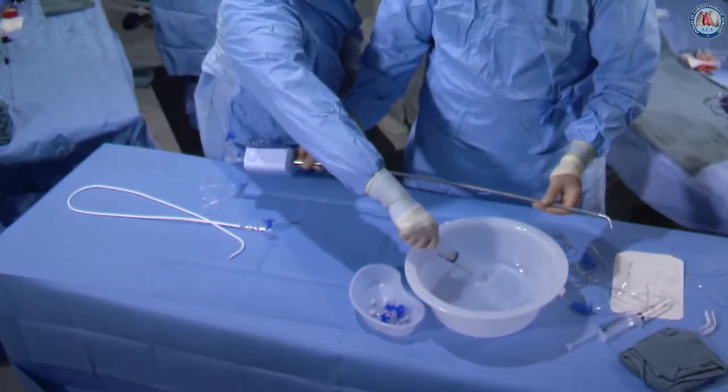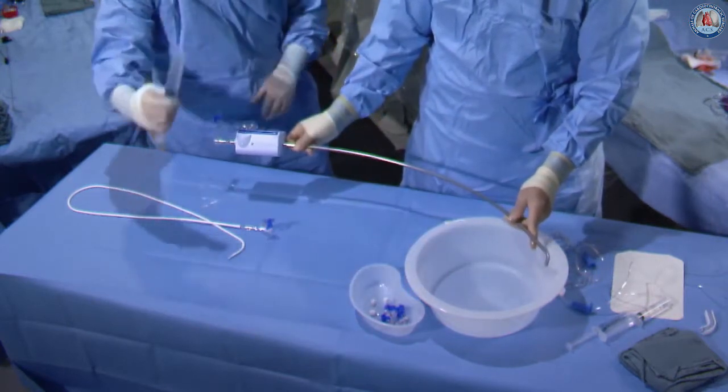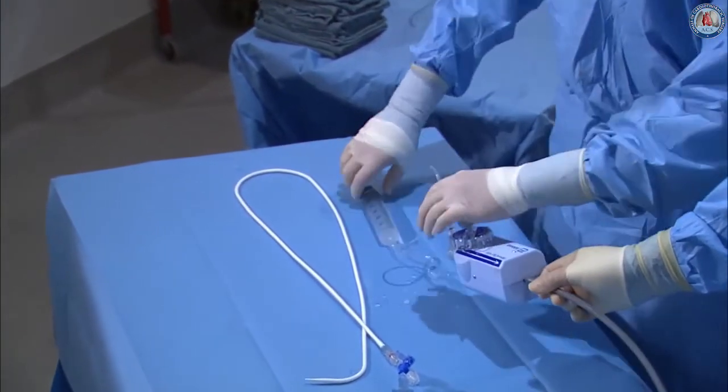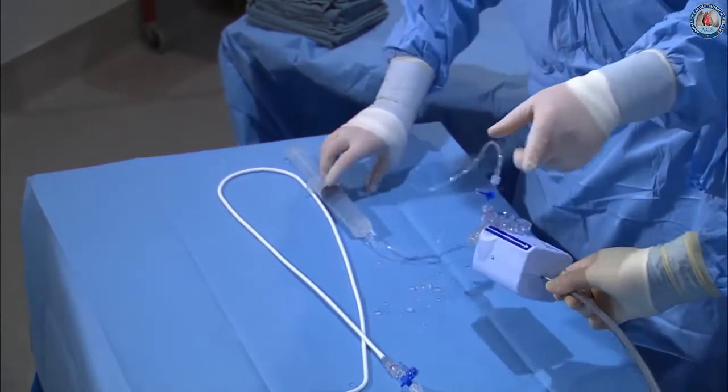We get a large syringe here — a 60 cc syringe with flexible tubing. We get all the air out, then connect our flexible tubing once again up to the sidearm of the guide, flush forward through the sidearm, and then we're going to stand the guide completely straight up in the air.